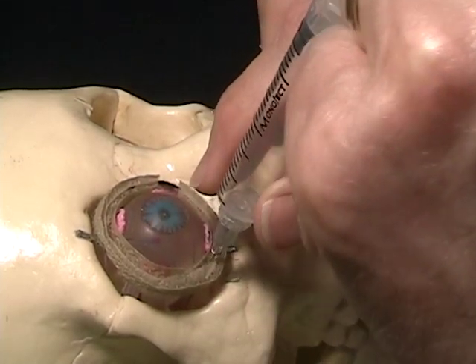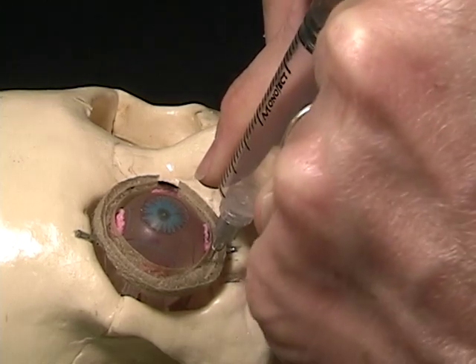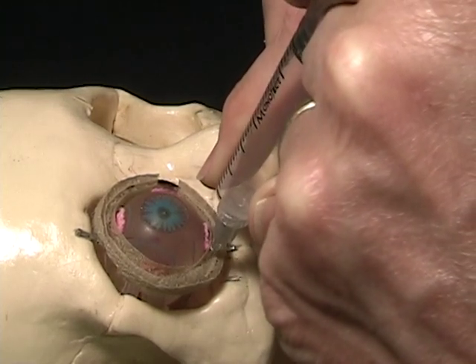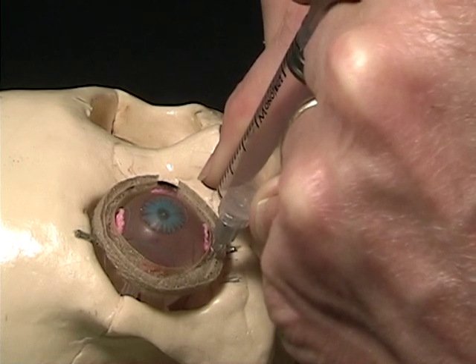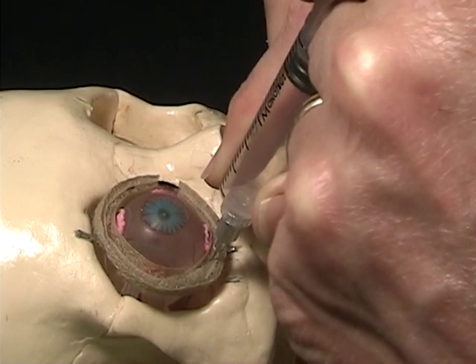Once the needle has been inserted the full 25 millimeters, we will secure the syringe, aspirate, and begin a slow injection of approximately 1 milliliter every 10 seconds.